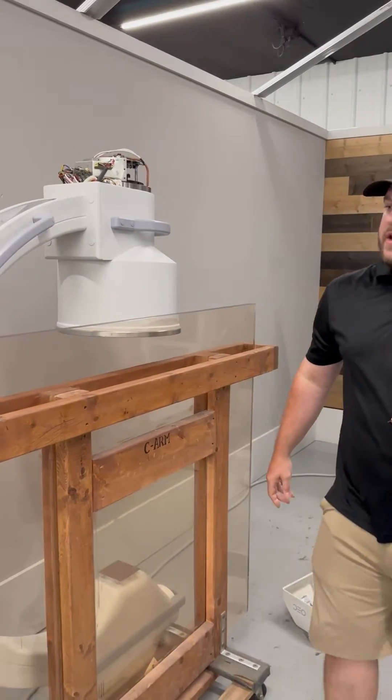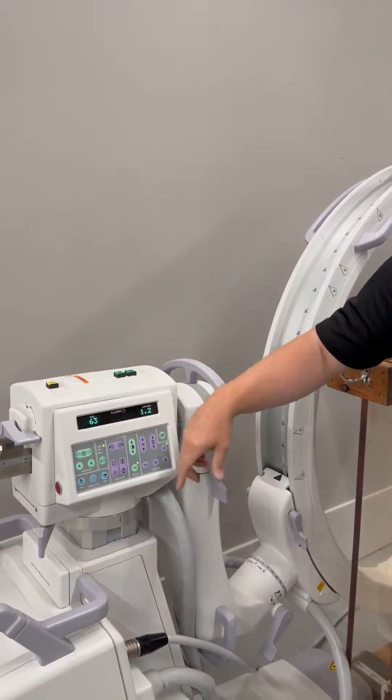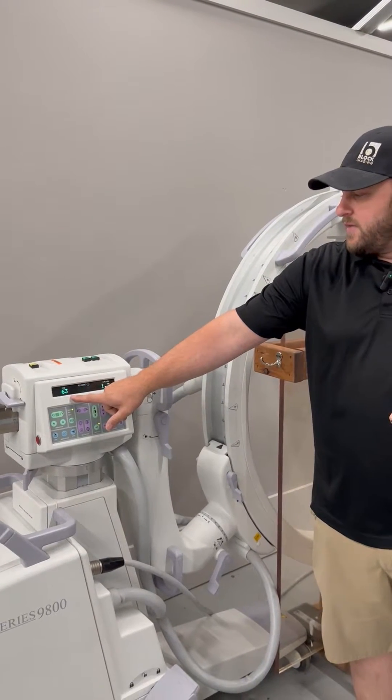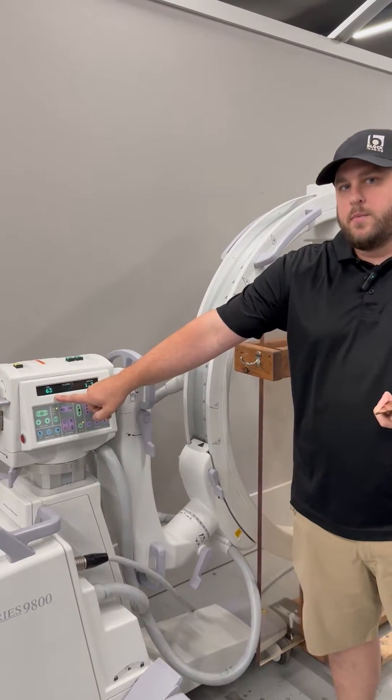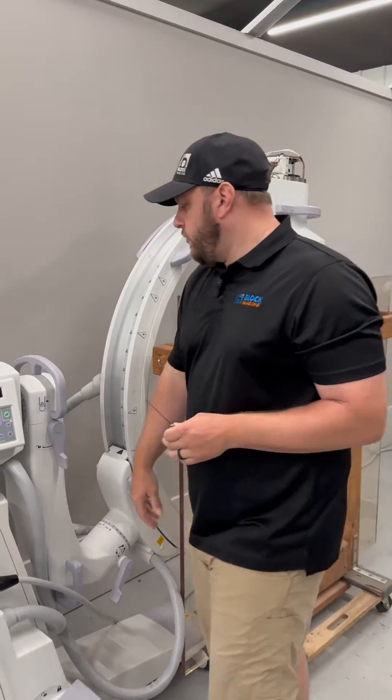First, we're going to take one sheet of copper and place it over our tube and go ahead and take an exposure. In this example, our KVP is coming in at 63, which is in spec, but we can dial it down a little to 61.